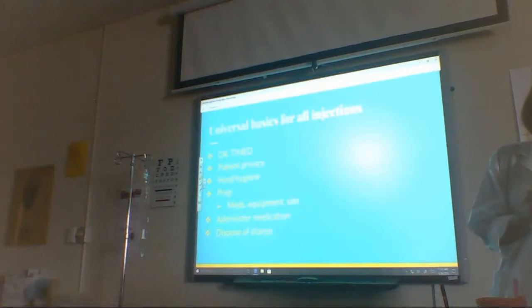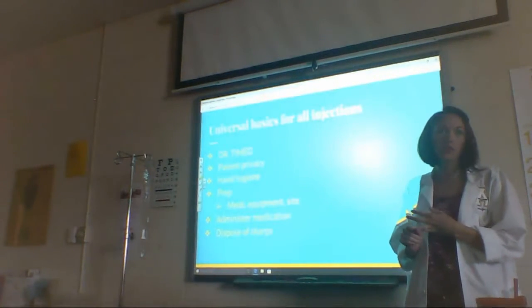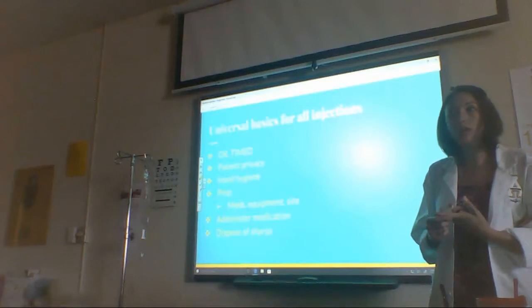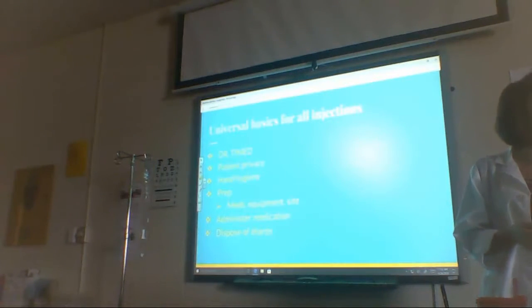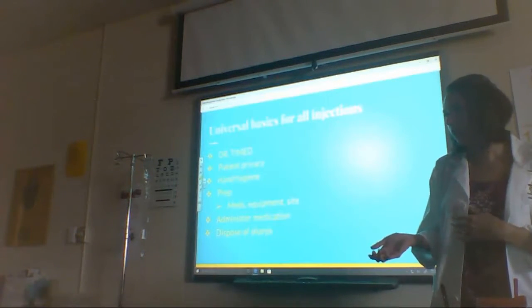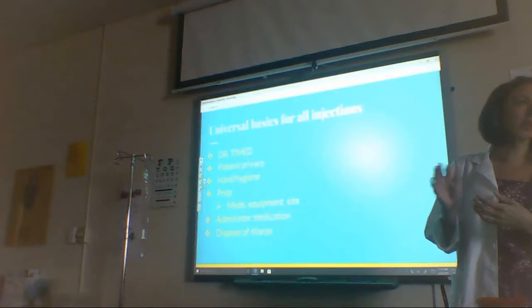Prep. There are several different things that you need to consider for preparation for your injections. The medication itself: you want to do your dosage calculations and make sure that the amount you're going to inject is appropriate. The amount that you're going to put into an intradermal injection is way less than what you can put into an IM injection. And even though you can give larger volumes with IM injections, there's still a cutoff point. There's still a ceiling limit on that.